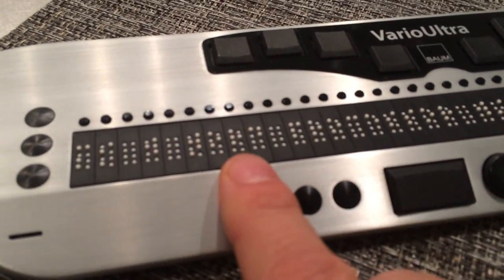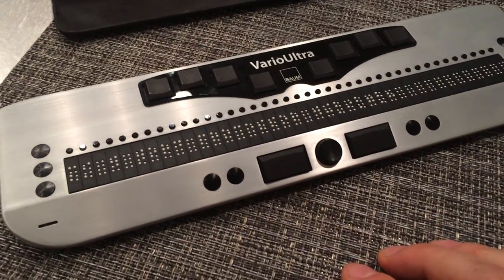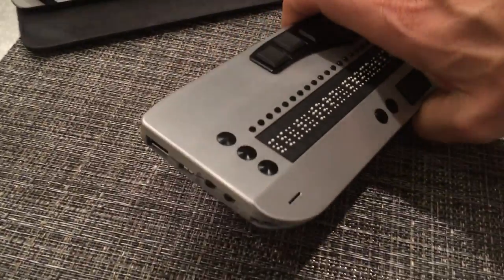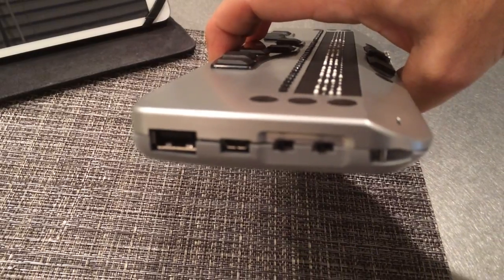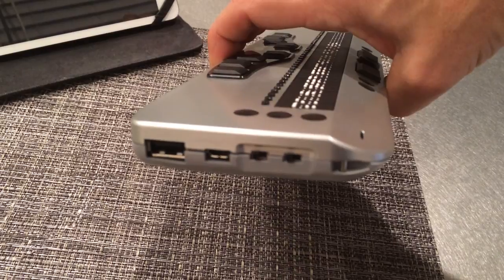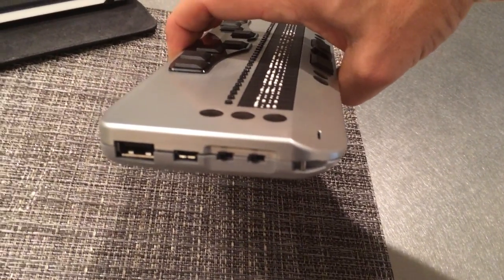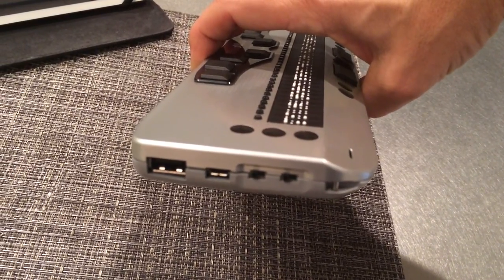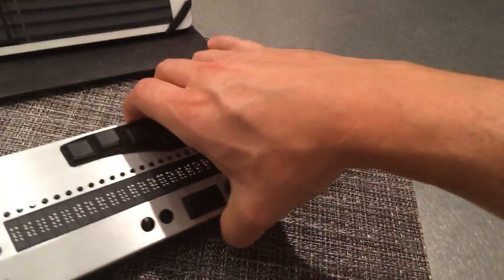Beyond that, the functionality of the device is the same as the 20-cell. That means that if I turn the device to the left-hand side, you'll see we have the same standard USB for connecting with a USB stick, the micro-USB for connecting to a USB charger or to a computer. And then there are two sliding buttons — one to switch between the Braille note-taker mode and the Braille display mode, and the other is the device lock, so you can lock all of the keys.